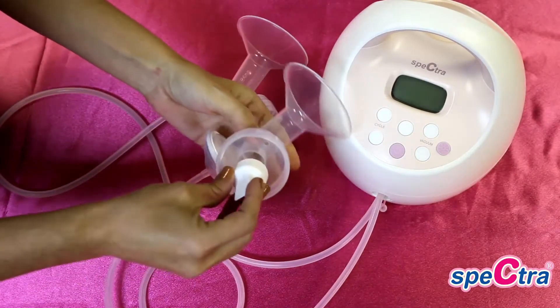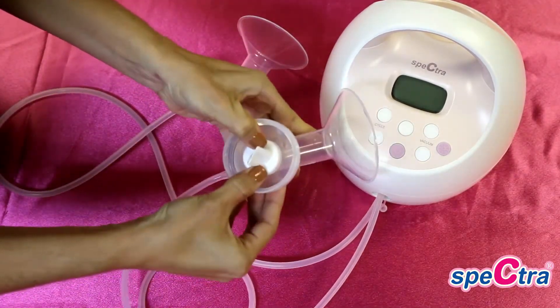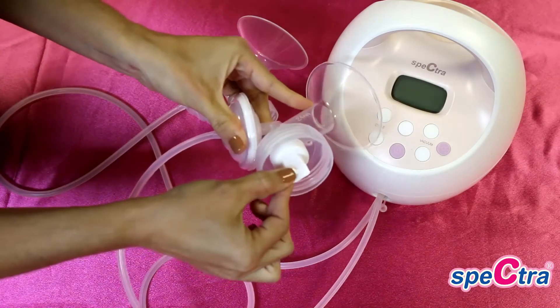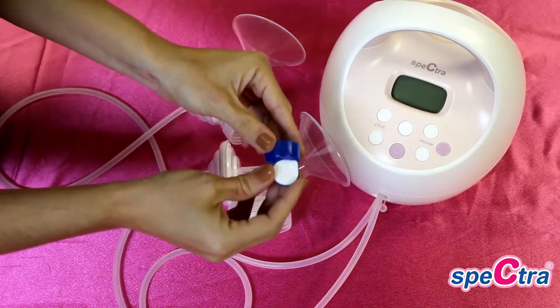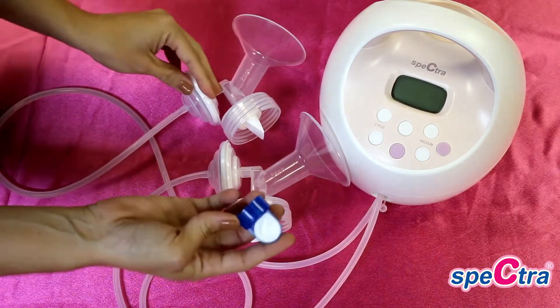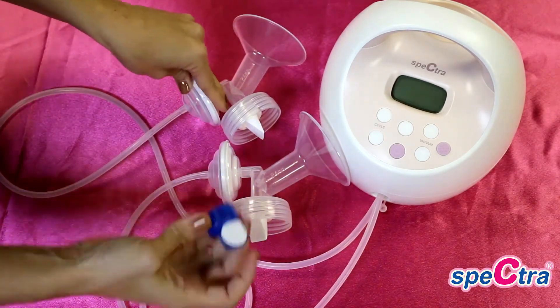You will next attach the white valve to the bottom of the flange. It will either be the white duckbill valve or the blue valve with white membrane. They both function the same to provide the suction — they are just two different designs.